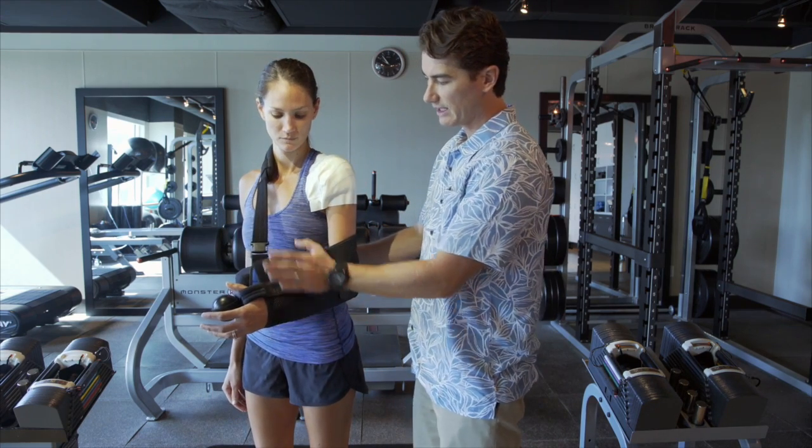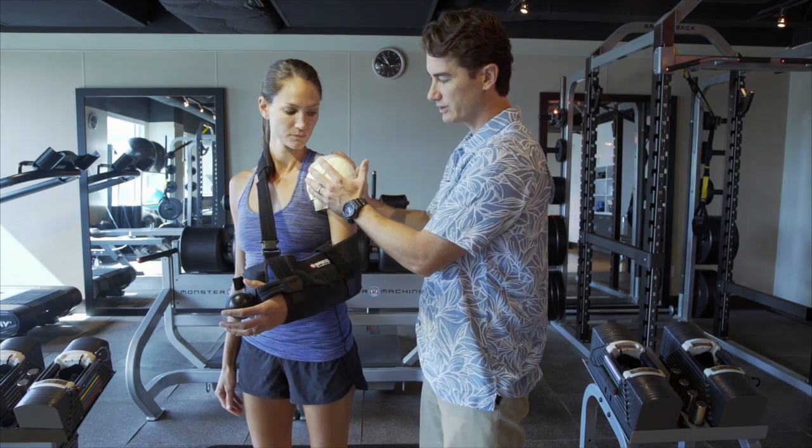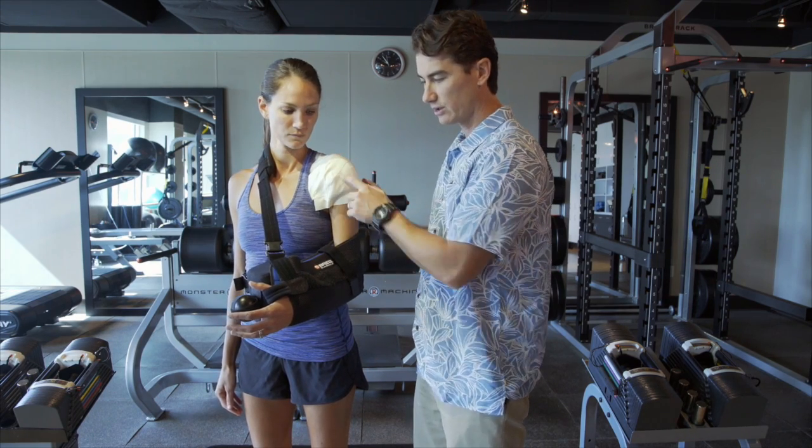What I'm going to go over right now is how to adjust this brace, how to take it on and off, as well as what to do with your dressings after surgery.